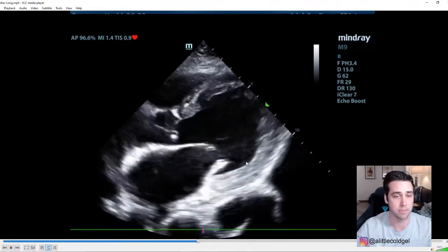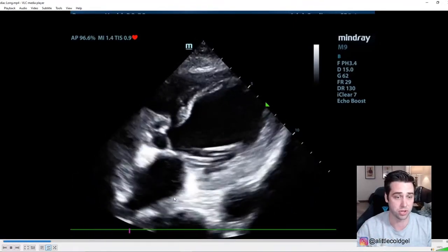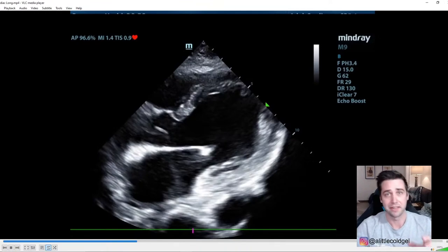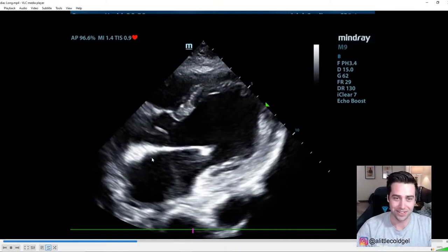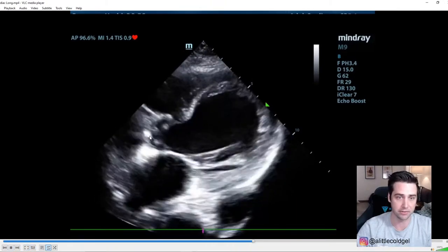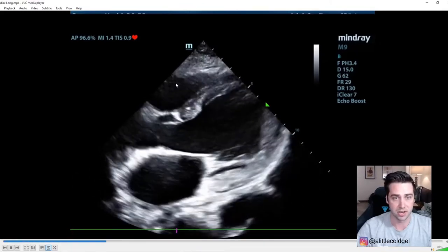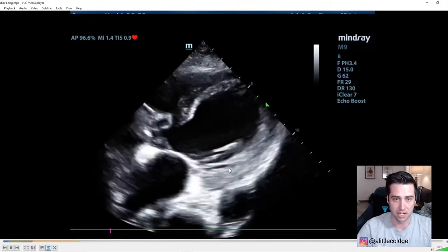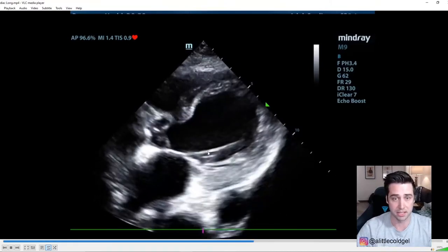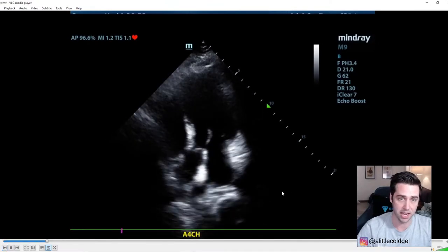This image is another parasternal long — you can see some of those structures a bit better. Left ventricle here, left atrium here, and this is your left ventricular outflow tract or aortic root. You can see the aortic valve flapping in that section, and up here is the right ventricle. Playing the clip again, you can see the aortic valve flipping, mitral valve opening, and the RV pumping. This ejection fraction also looks really poor — the EPSS is large and the mitral valve isn't getting close to the septum at all.